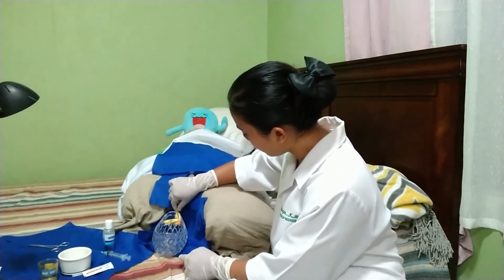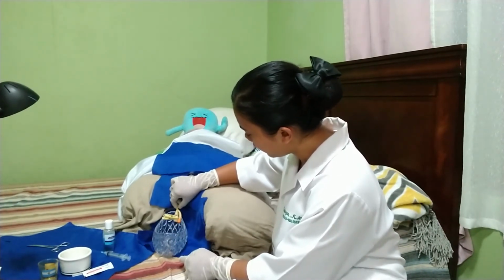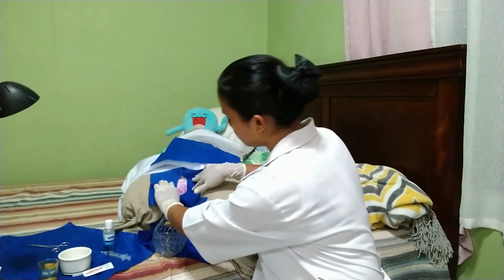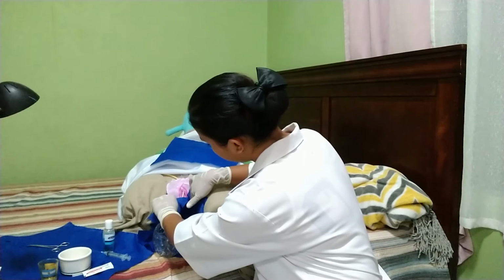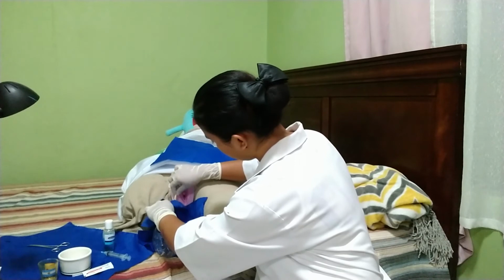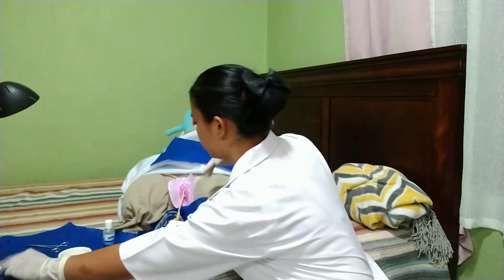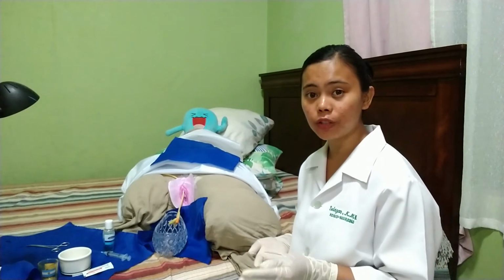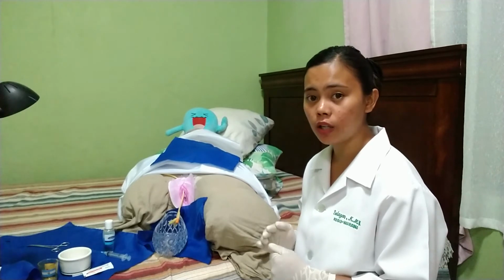Retract the catheter to check the proper placement of our catheter if it's at the junction of the bladder and the urethra. Then we may now remove our fenestrated drape. You may also use the fenestrated drape to wipe the betadine solution over the labia or the perineal area. After removing the fenestrated drape, we may now attach our urinary bag to the catheter port and hang it on the bed frame, not on the side rail.